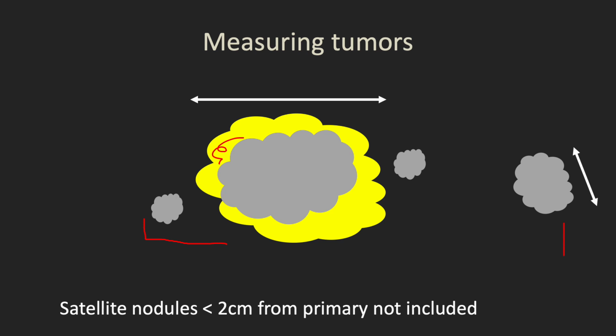And these maximum dimensions may not be our standard planes, and may not necessarily be standard transaxial or sagittal imaging planes. We really should rotate that probe or have a look at things on MR until we can find our maximal measurement.